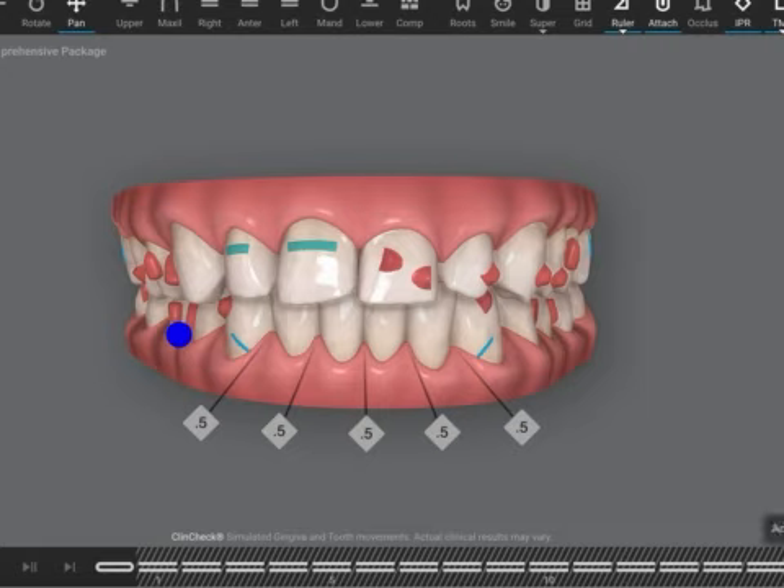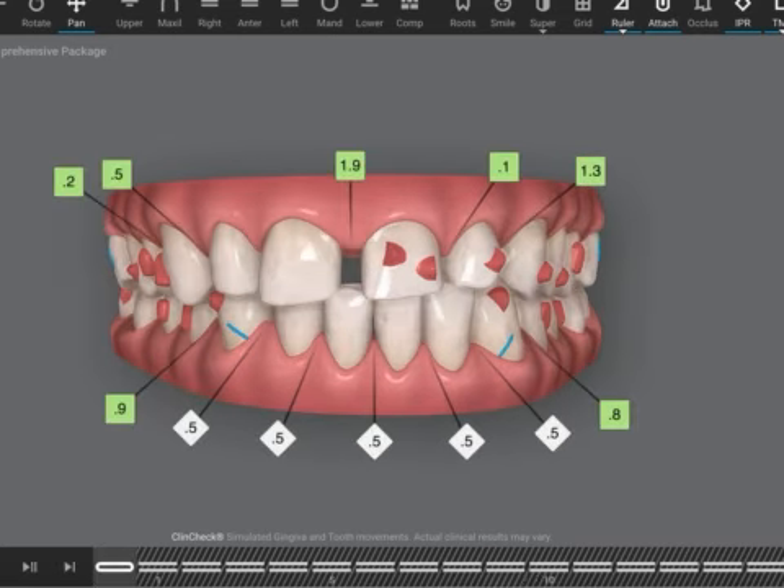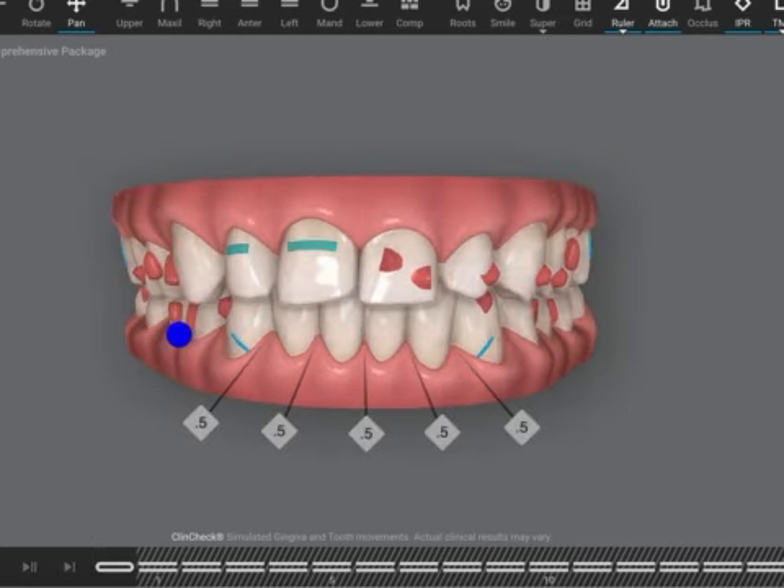16 aligners is nothing — I would at least double it. Do not expect that the teeth are going to move from here to there without side effects and tipping, so you must have attachments on both these teeth.